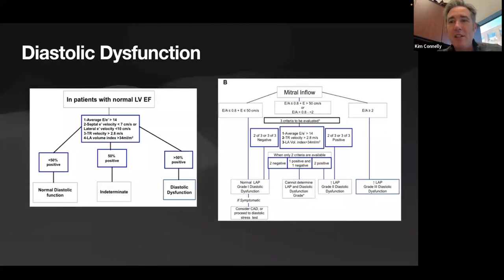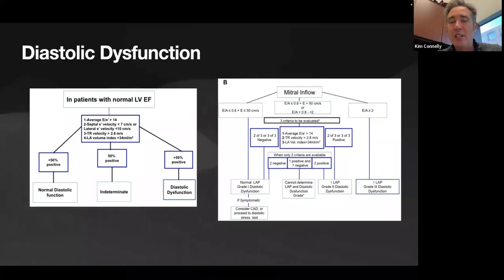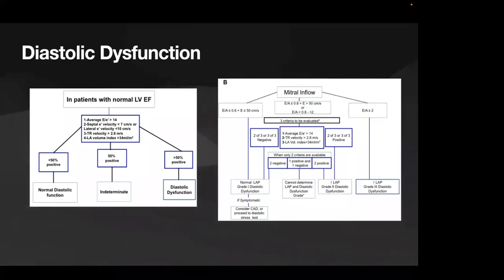There was one about can you use a Valsalva maneuver to assess the changes in the E/A pattern. I wondered if you wanted to comment on that. Yeah, it's actually really interesting.